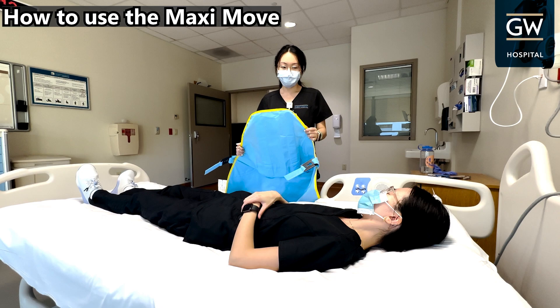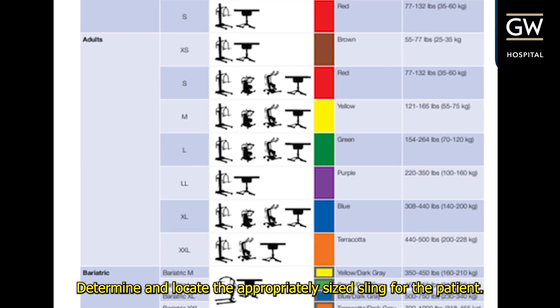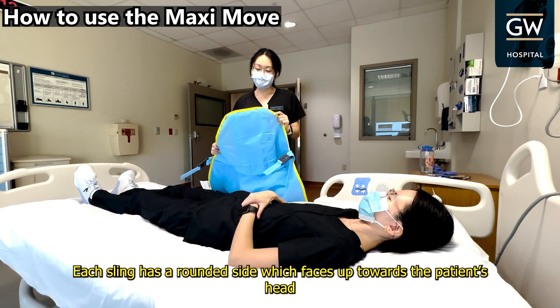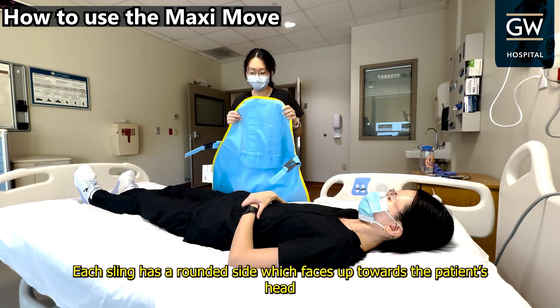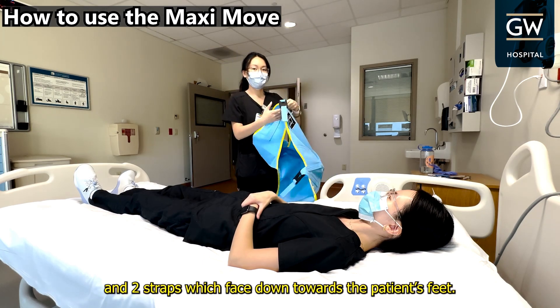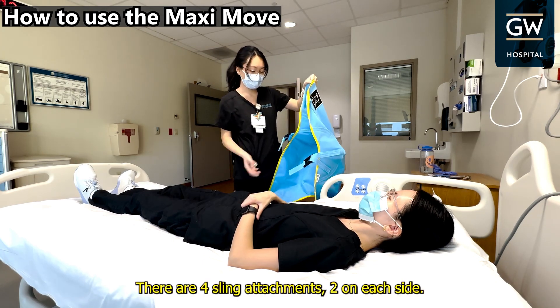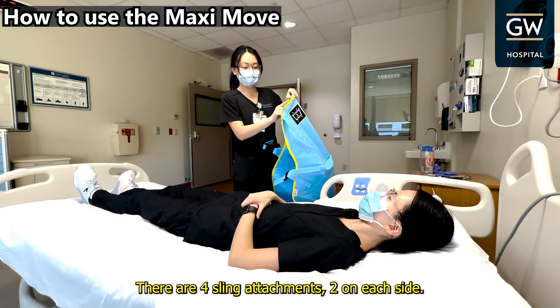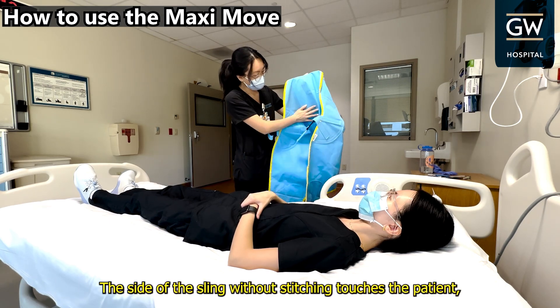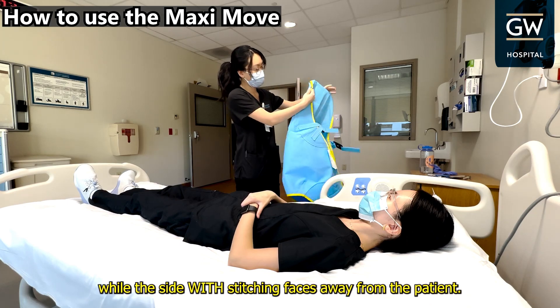How to use the MaxiMove. Determine and locate the appropriately sized sling for the patient. Each sling has a rounded side, which faces up towards the patient's head, and two straps, which face down towards the patient's feet. There are four sling attachments, two on each side. The side of the sling without stitching touches the patient, while the side with stitching faces away from the patient.